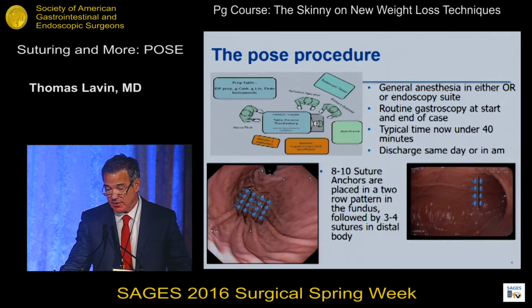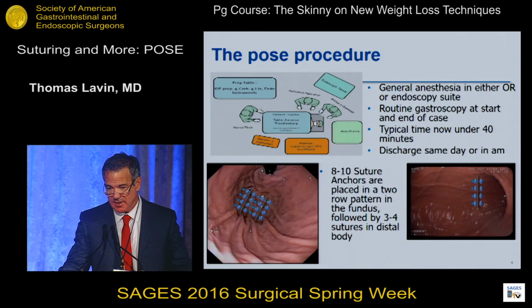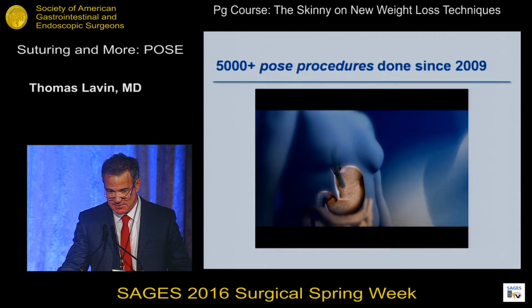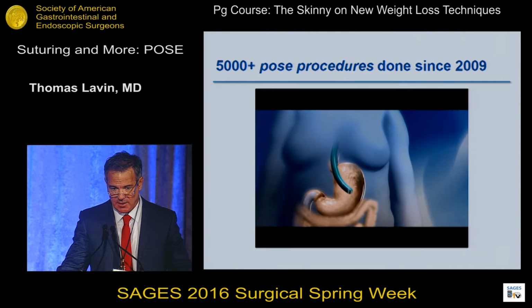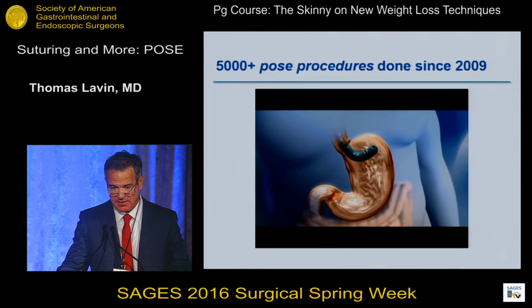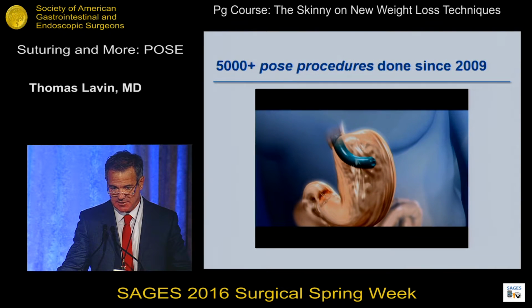You place 8 to 10 sutures up in the fundus, and the device that allows you to get there is fixed, and it allows easy access to the fundus to really bring down the entire fundus, and you'll see some pictures of that. We also put 3 to 4 sutures in the distal body at the end of the procedure. So this is the transport coming down, and we get in the retroflex position, and it fixes in this position. It gives you great access, once again, to the fundus.